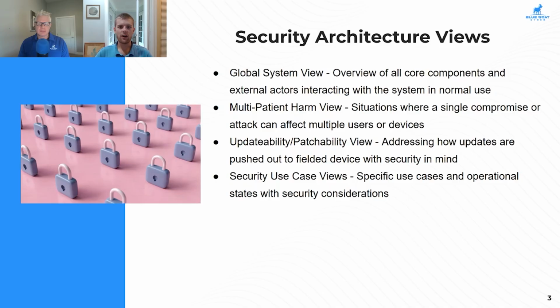Security use case views are directed towards specific use cases and operational states and how we're addressing security in them. There is a lengthy list of recommendations provided by the FDA on what should be addressed here, though in general, we want to look at any state of the device and how the data flows are working during that state. So for an example, if we have Bluetooth, USB, and HDMI, how are those all going to have different security profiles during normal operation, during standby, during power off, during power on? These are the type of things that we're looking at with our security use case views.